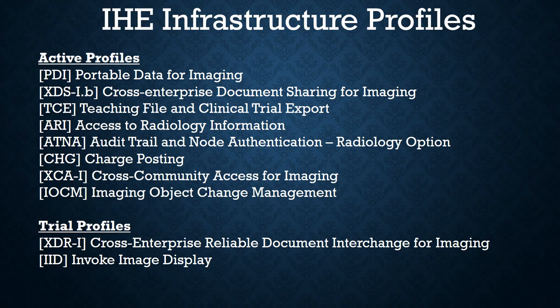Today, let's talk about IHE Infrastructure Profiles. The active profiles are PDI, Portable Data for Imaging, XDSIB, Cross-Enterprise Document Sharing for Imaging, TCE, Teaching File and Clinical Trial Export, ARI, Access to Radiology Information, ATNA, Audit Trail and Node Authentication, with the radiology option, of course, CHG, Charge Posting, XCAI, Cross-Community Access for Imaging, and IOCM, Imaging Object Change Management.